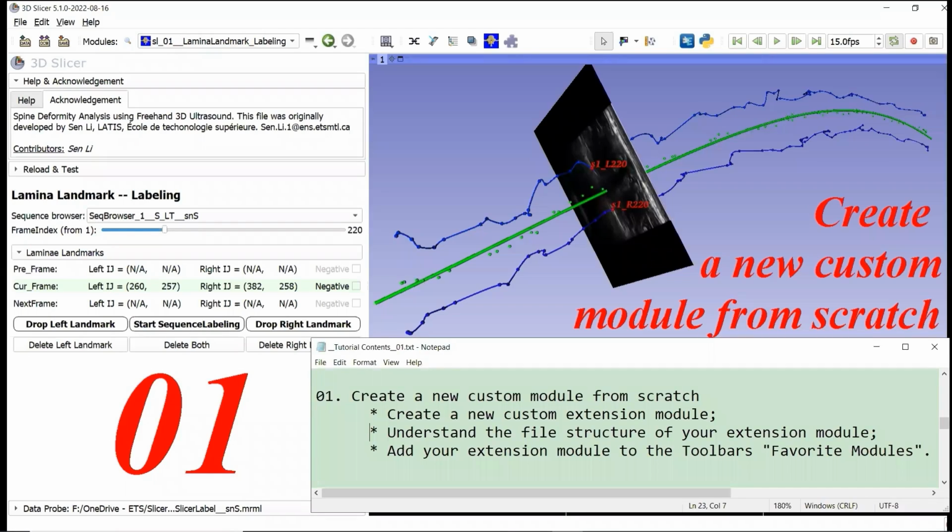In this video, we will create a new custom extension module together, understand the file structure of your extension module, and add your extension module to the toolbar's favorite modules.